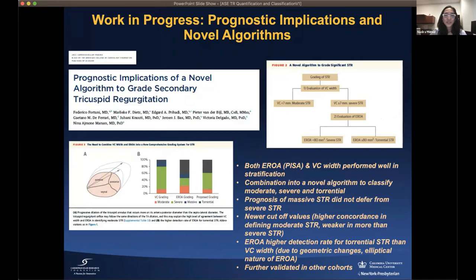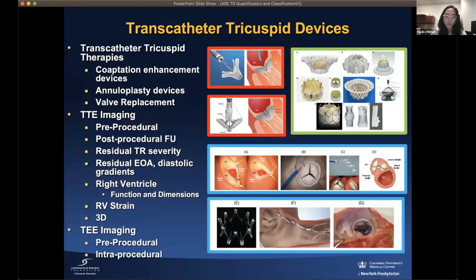This is a work in progress. A paper by Fortunato and colleagues highlights the prognostic implications of a novel algorithm to grade TR. In that study, both EROA by PISA and vena contracta width performed well for stratification, and were combined into a novel algorithm to classify moderate, severe, and torrential TR. There are newer cutoff values, but they require further validation in other cohorts.